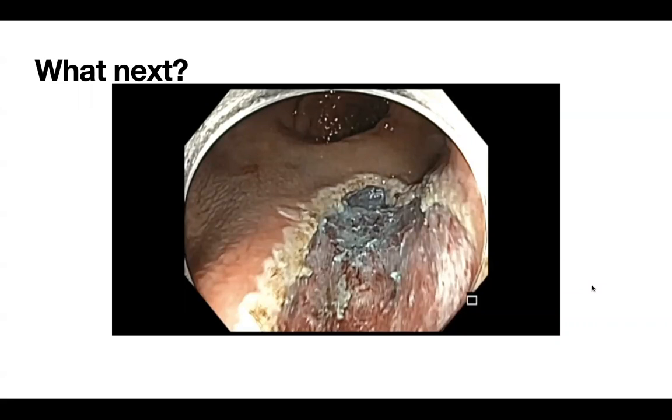The point you always make at Path Conference, which is, why didn't you just remove it? Why did you send it to somebody else to address? I don't see myself in this position having to deal with these blood vessels because I'm probably a little bit too chicken to address this type of a lesion. But I think the right thing to do would be to address the blood vessels so that they don't bleed afterwards. That's what I would do if the EMR location was different. So we should probably do that here.